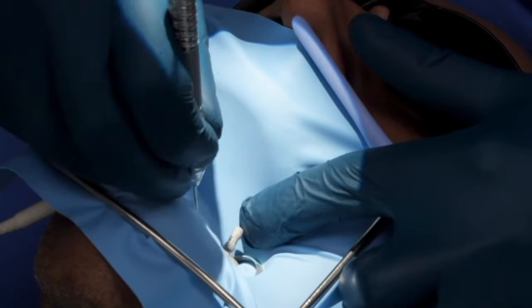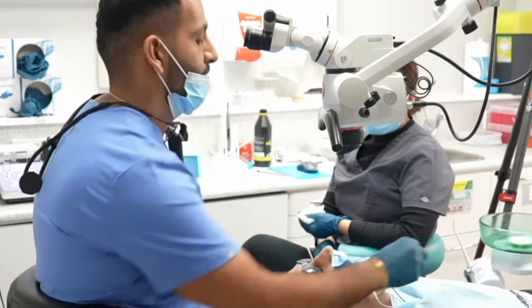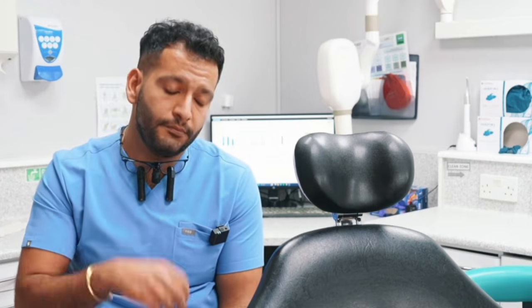For me, I tend to use a glide path file in most cases, and the 15.03 is a glide path file that I really like because of how flexible it is. It hardly has any restoring forces, and it has great cyclic fatigue resistance. That enabled me to get down to working length in a pretty predictable way.